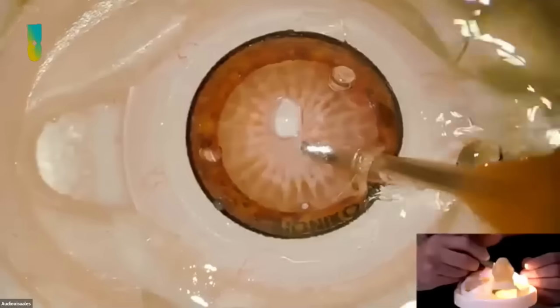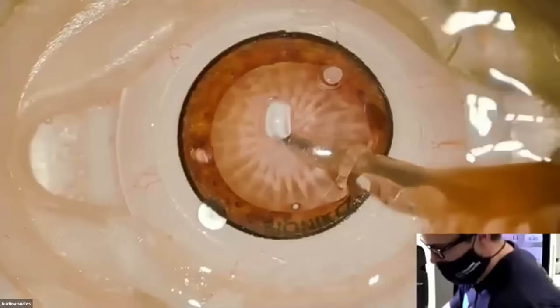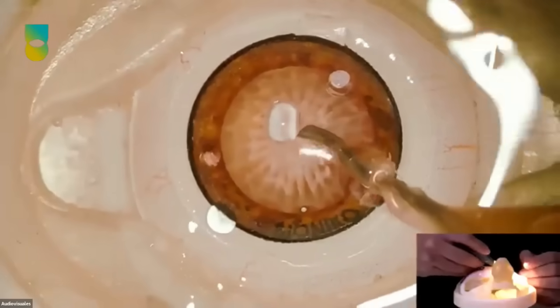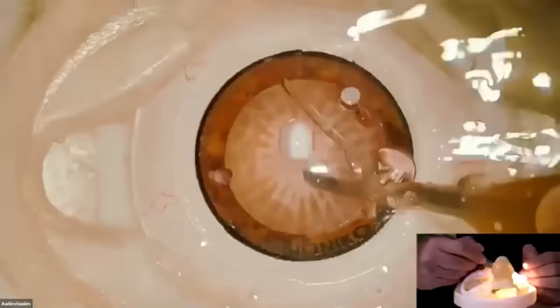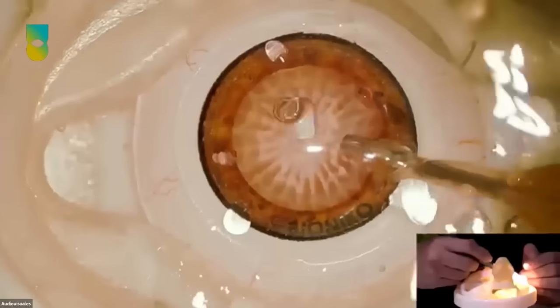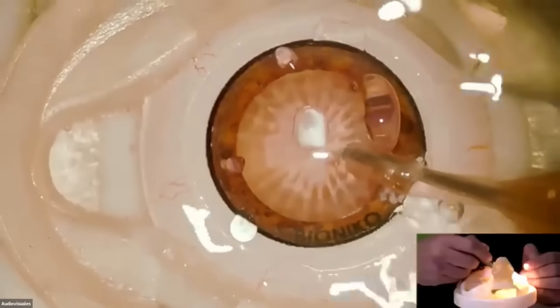So what is important to do sometimes when the tip gets a little bit tight like this, like we can see, it's good to have the other device in your hand, like a Sinskey or a Chopper, to hold the secondary incision to assist the surgeon.